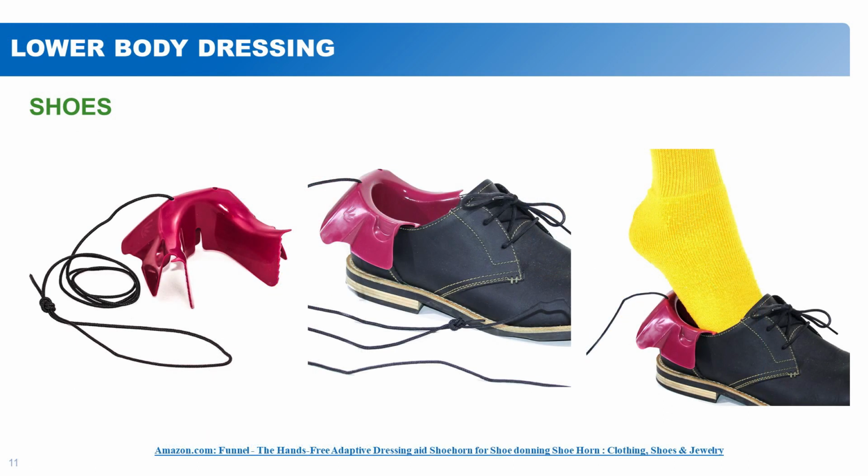This next device is called a foot funnel. It has a plastic molded area with a string. You hold on to the string and put the device inside of the shoe and then slide your foot into the shoe. After your foot is all the way in the shoe, you can pull out on the strings and it leaves your foot in the shoe. The advantage of this product is that you aren't pushing down on the heel of your shoe and breaking down your shoe after repeated use.